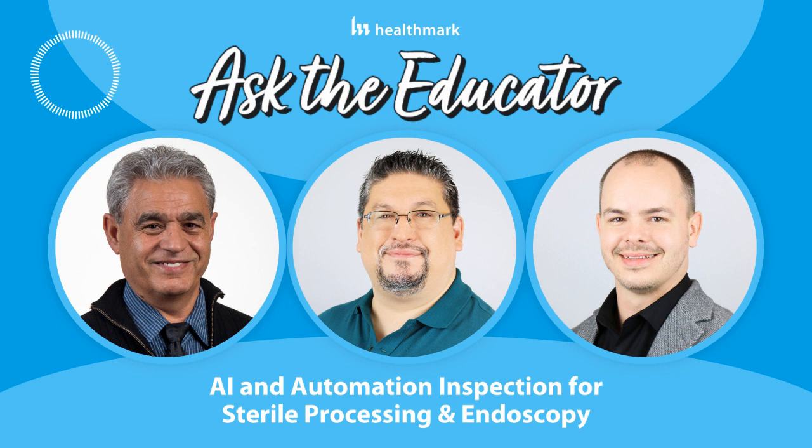Most of the IFUs say that if you find some kind of stuff on the instrument, you need to wash it and clean it. For example, the Olympus 190 duodenum scope IFU says to inspect all the items, and if you see any debris, you need to repeat the steps to make sure all the debris is cleaned. So that's really at the basis of it.